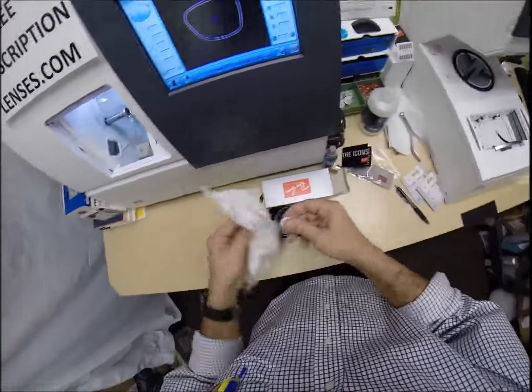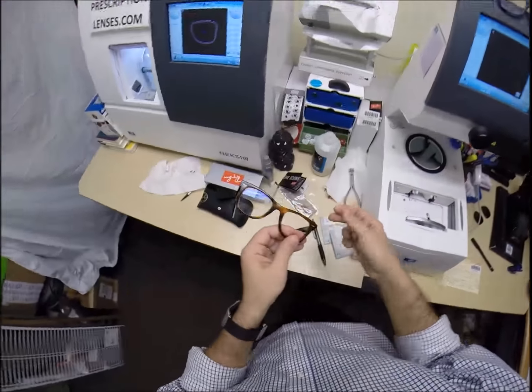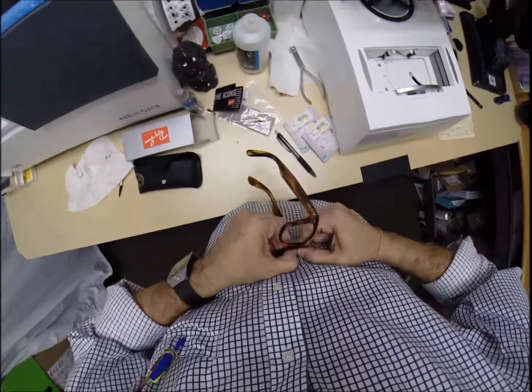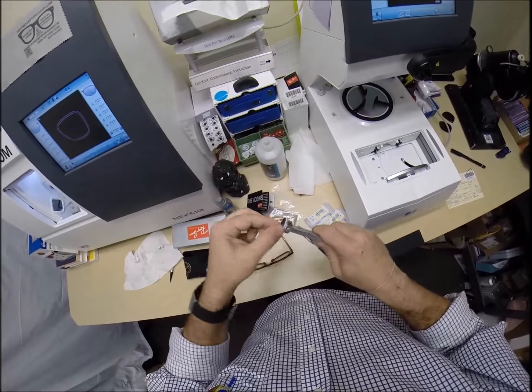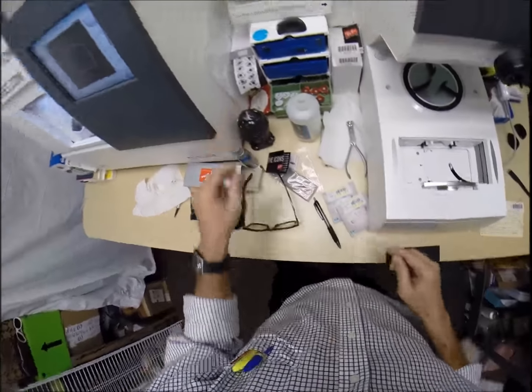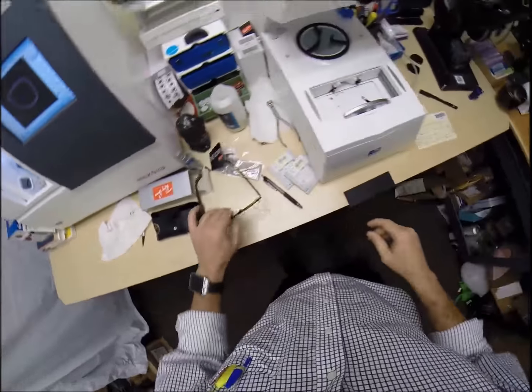So let's dry that off. Let's see if this fits in there. If I can find your frame, we'll see if it fits in there. Tuck the lens in at the outside corner. Using my thumbs, I press down at the nose, and it snaps right in. Take the block off. Keep working. I'm going to stick this one on the top. Let's do that. Got to keep my sticker monster growing.